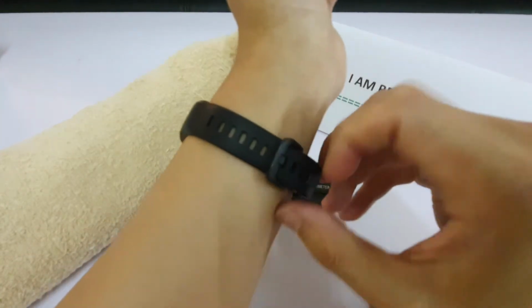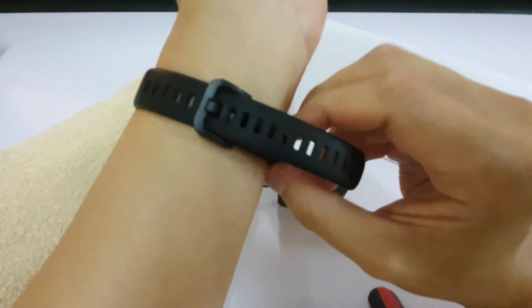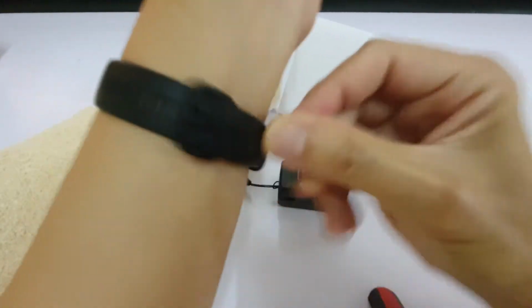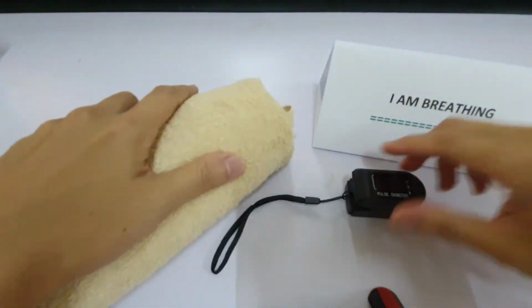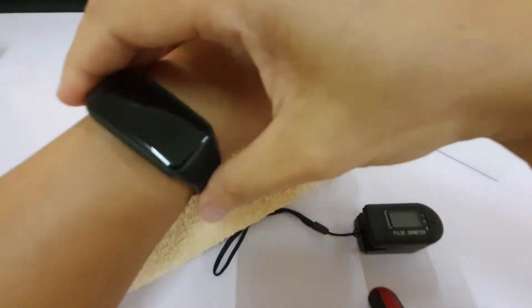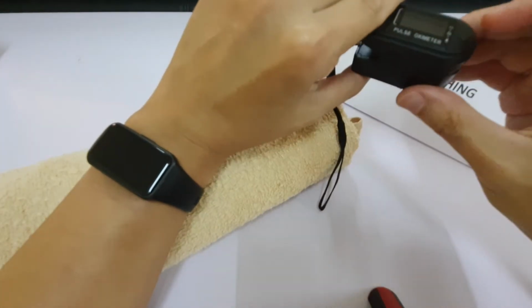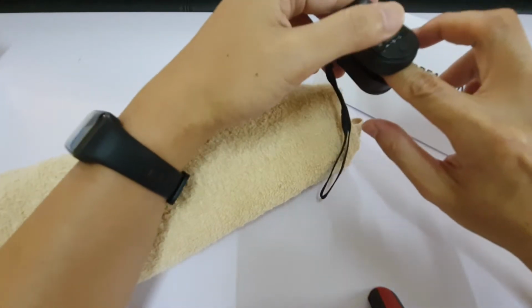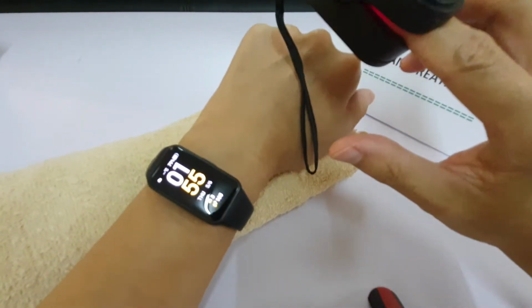So let's wear this tightly, as I should be. This is fairly tight, and then you've got to rest your hand and not move it around. So let me do this. Let me just put my forefinger inside. Okay, and I'm going to turn on.